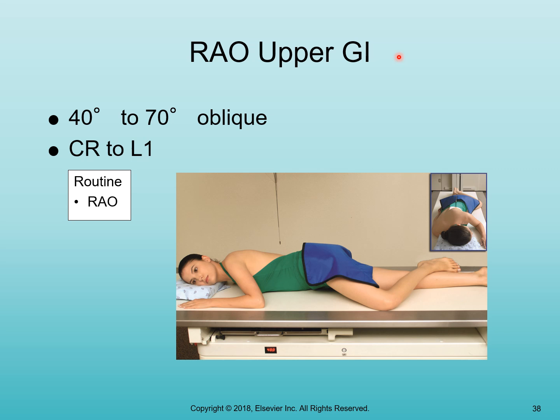The LPO, I'm okay with the left marker, but it's in the opposite location. It would be down at the bottom. And then the RAO, it's a left marker, but it's up, just like they have it on 494.